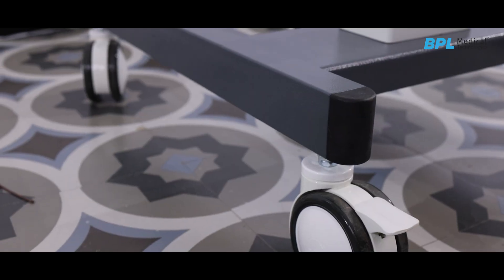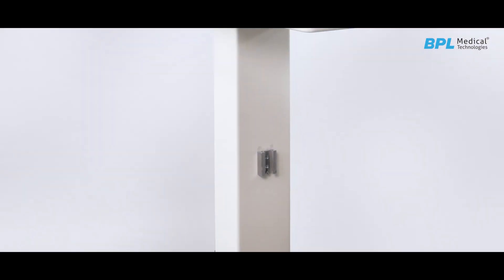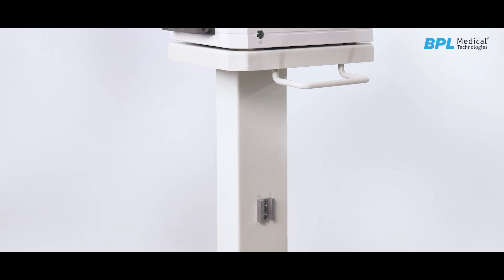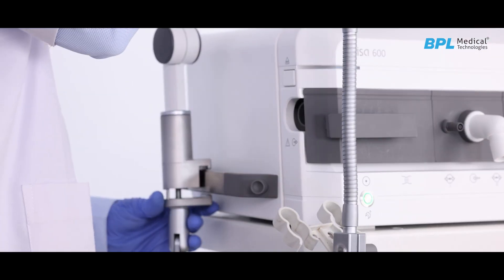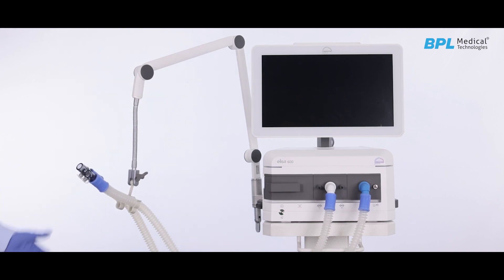A trolley assembly with holder is provided to mount the heater humidifier assembly. An optional air compressor mount caster is also available. The articulating support arm can be used for hanging the breathing circuits.